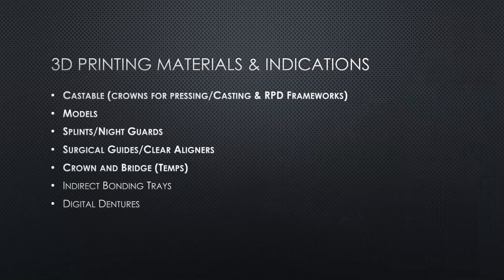When they first started in 1997, they would work on traditional stone models and segment the teeth, move the teeth slightly, and then duplicate the models, and then they'd segment the teeth again, move them a little bit more, duplicate the models, and go on and on. And on average for each case, Invisalign produces about 40 models per patient for comprehensive orthodontic treatment.